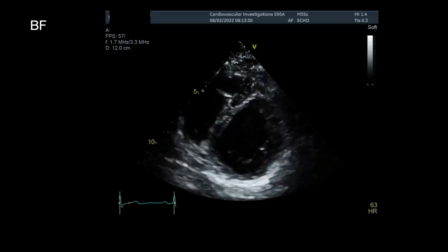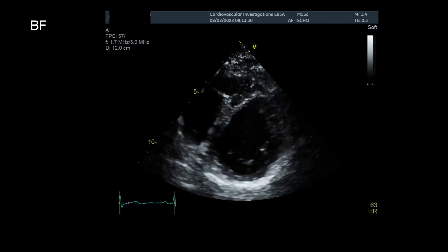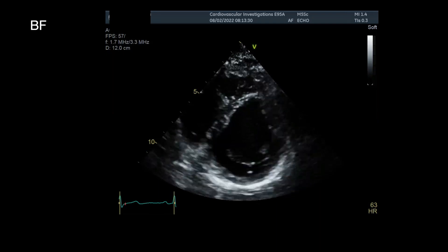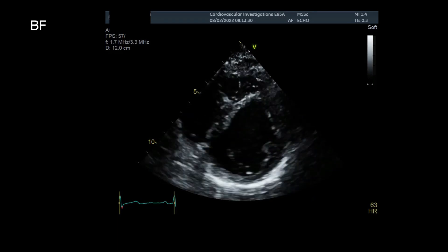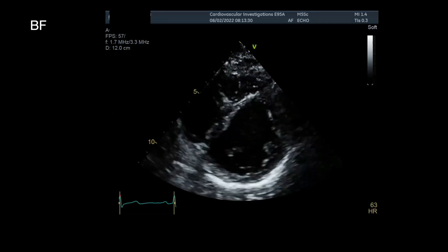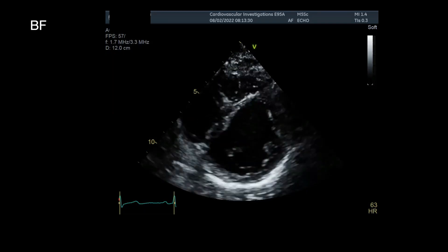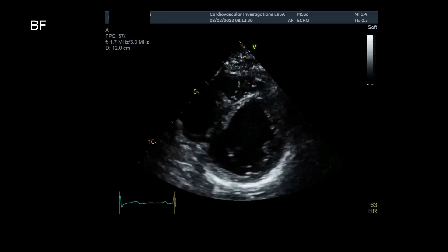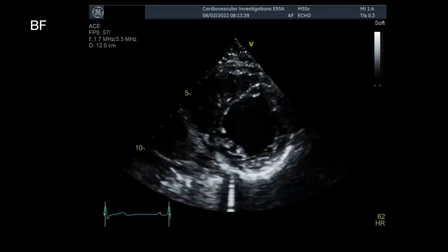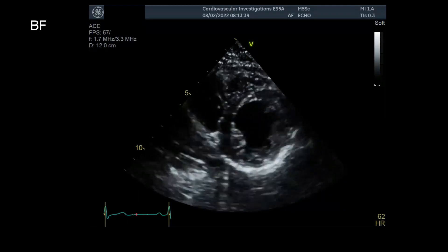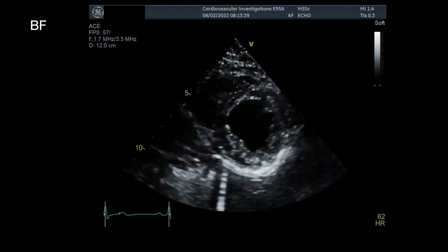In the parasternal short axis view at the level of the mitral valve, we look at the septum. You could argue there's a bit of septal flattening, but we'd need to confirm that in subsequent images. Moving down towards the papillary muscles, the septum looks more normal — concave to the LV — and the RV doesn't look particularly dilated.